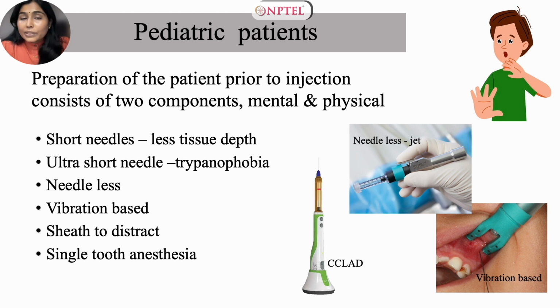Administering local anesthesia to pediatric patients presents unique challenges. Preparation of these patients requires two components, mental and physical. So you can consider the following ideas while handling a pediatric patient. Consider using short needles or ultra short needles because of the fear factor towards needles in these patients. Also, these short needles are ideal because of the lesser tissue penetration depth required in these small individuals. Sometimes you can also consider the use of needleless techniques. And to distract the patient, we could use the vibration based equipment.